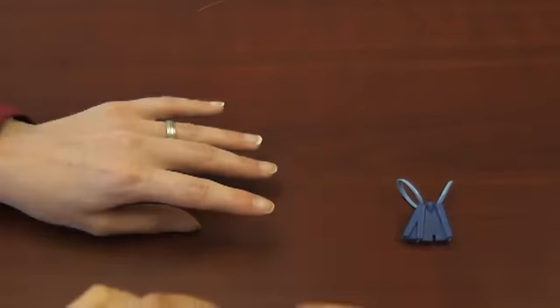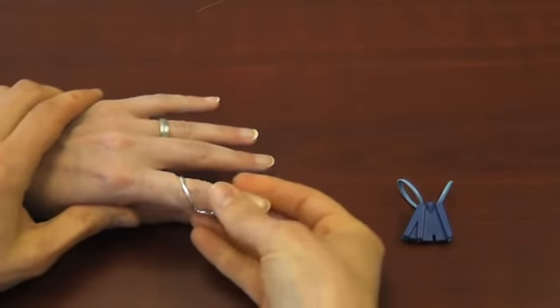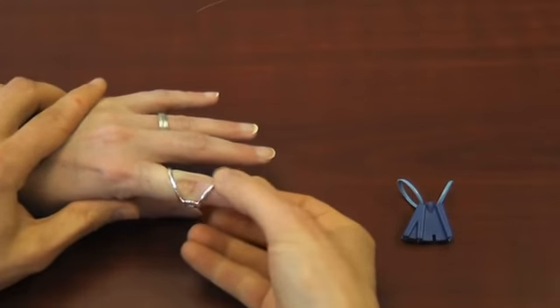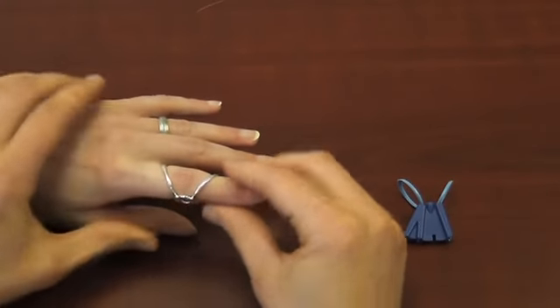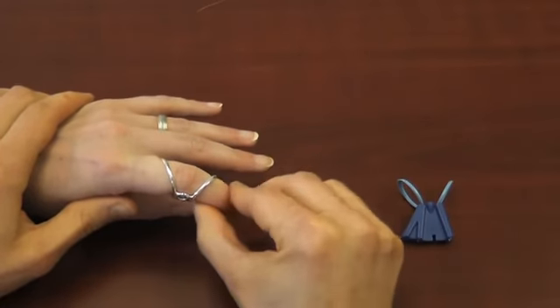The small circle will act as the fulcrum point and should be positioned at the joint on the side opposite the direction the finger is deviating. To position the splint, you may have to rotate or twist it into place.